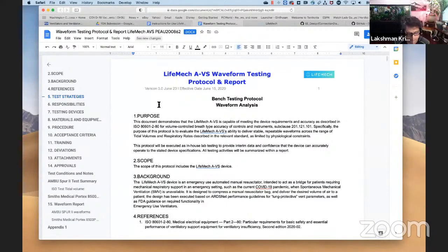When we started the development, we only had a bit of a breadboard. Everything was spread out all over the place. We didn't have any enclosures or anything like that. As it came together, we found that we needed to measure all the attributes of the system. We had to put it in a real environment.